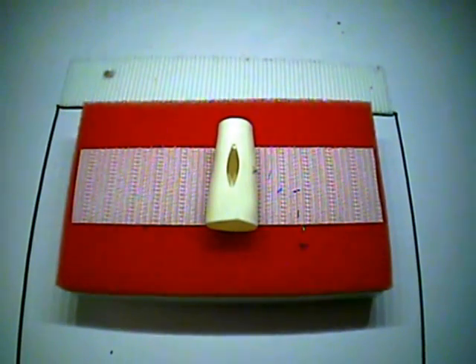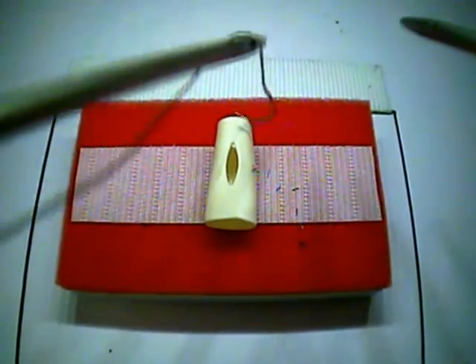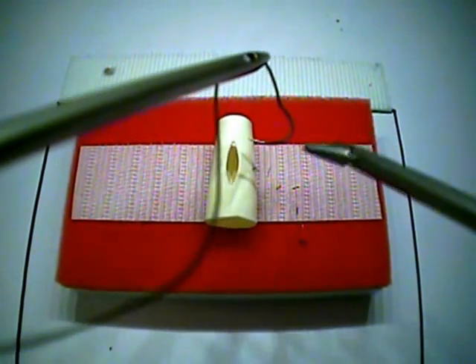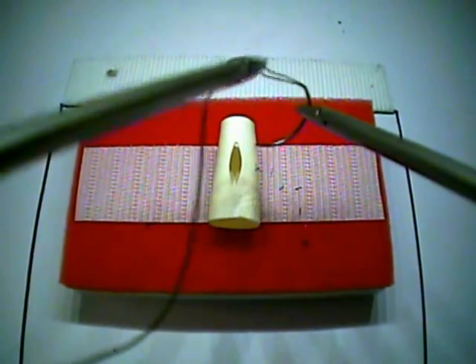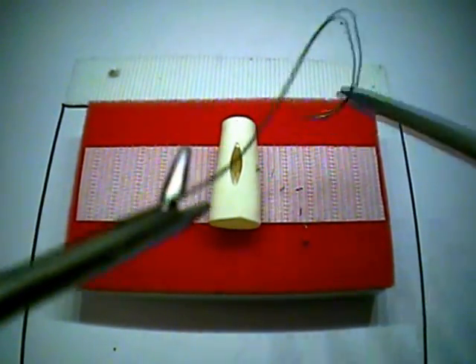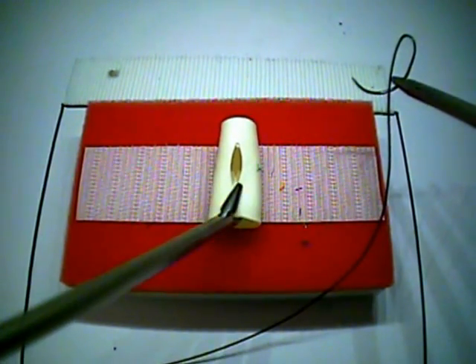Task number five, the intracorporeal suture. As demonstrated previously, the needle was oriented in the non-dominant hand outside the box to make transition to the throwing hand easier once you are in. Time on this exercise starts once the needle and instruments enter the field of view.